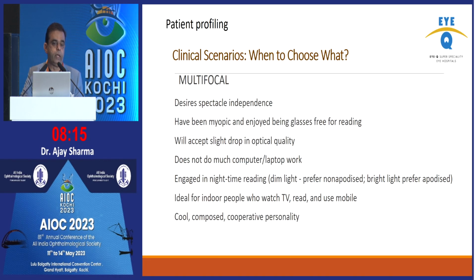Now multifocal lenses: they desire spectacle independence, have been myopic and enjoyed being glasses free for reading, will accept a slight drop in optical quality, do not do much computer or laptop work, are engaged in nighttime reading, and have a cool, composed, cooperative personality. This again is very important. If a patient is fussy, you don't go in for a multifocal lens. So this is why we chose a multifocal lens here.